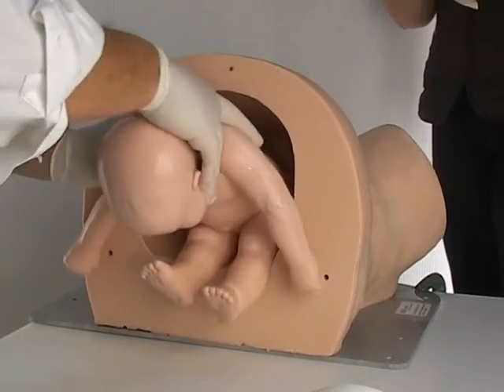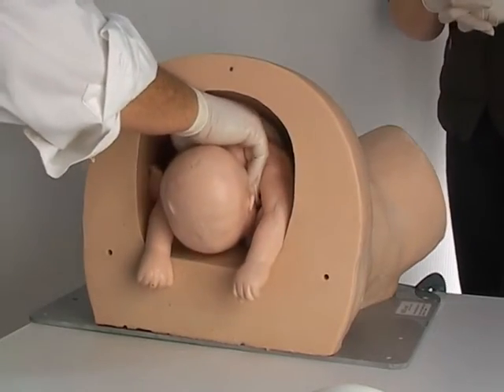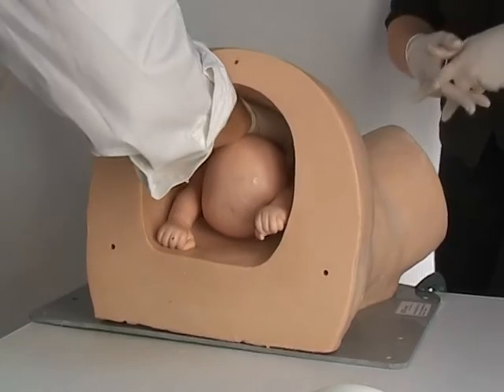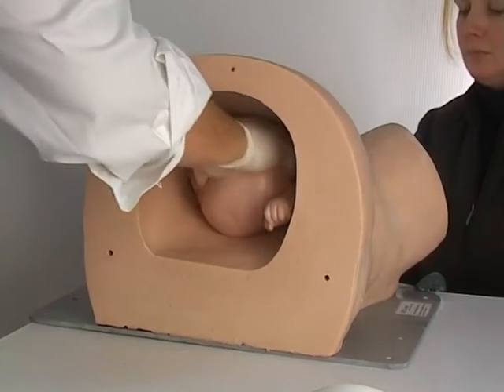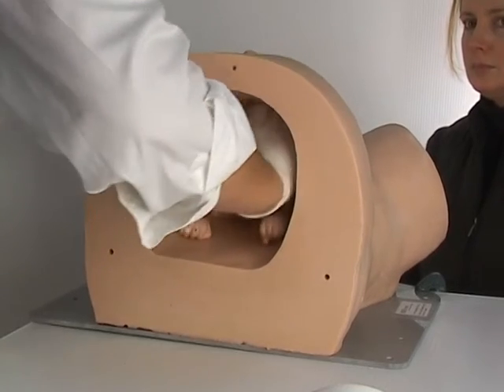In this scene, you can see a typical scenario with Sophie and her Mum. There are two people using the model — one is simulating the birth, while the clinician at the other end can practice the various manoeuvres and techniques used in a breech birth.